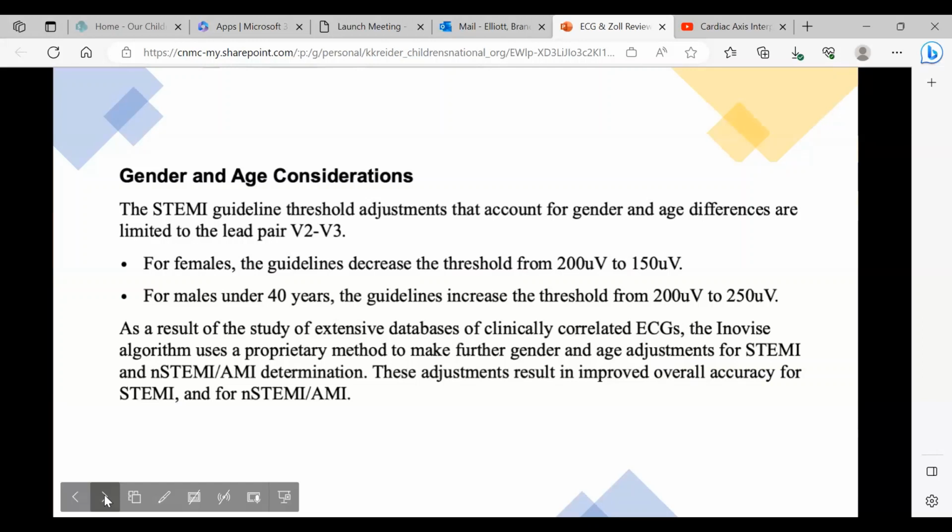Oh. So would it even be helpful if we left it at 45 if we're doing a 13-year-old, but changed the gender? I would change it to a more appropriate age. You would put the right age and the right gender in. It'll still interpret because you're in adult mode. Okay, so ignore the age, it's just for data, for labeling. I just want to make sure it wouldn't not interpret my data because I put in 13. No, it would not preclude it because of the age. It's the mode only. Got it. Thank you.